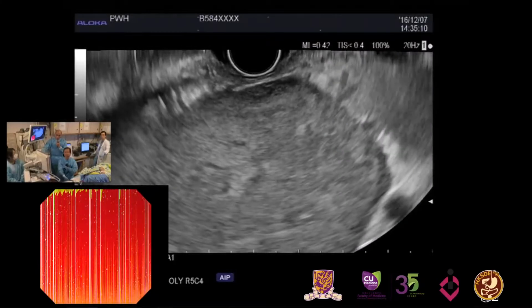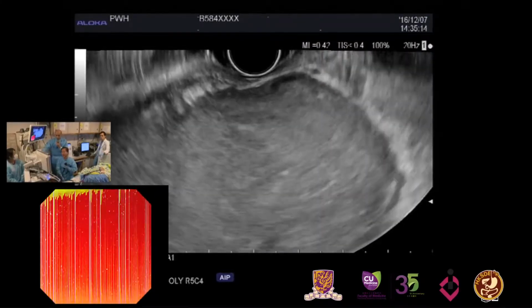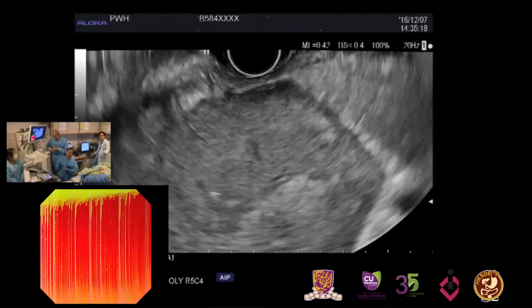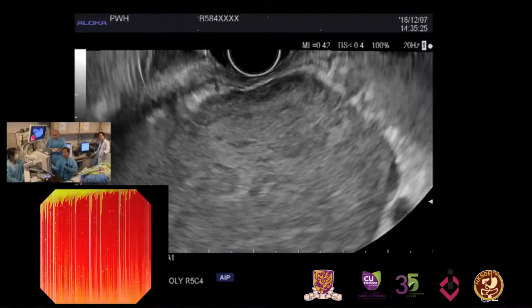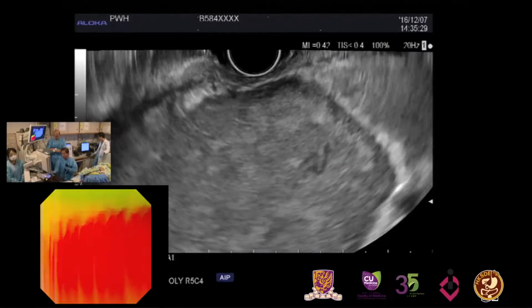So Dongwan, how do you assess, obviously this lesion is very large, but are there any other features that are suggestive of malignancy? Yeah. One is the size, which is also one of the criteria. If it is more than 5-6 cm, the probability actually increases. Definitely. This is already 12 cm, around 12 cm, so hugely.